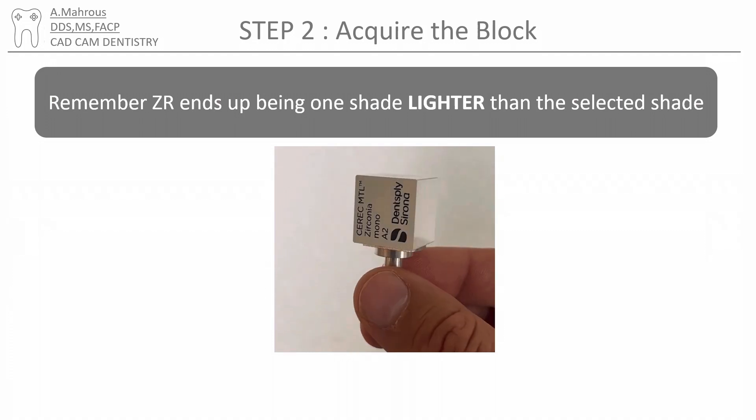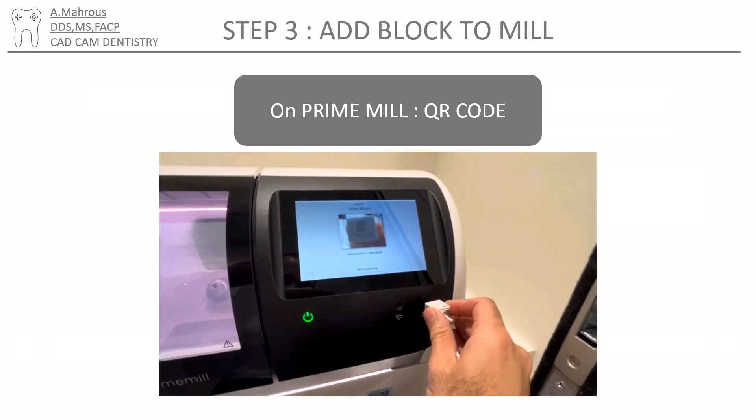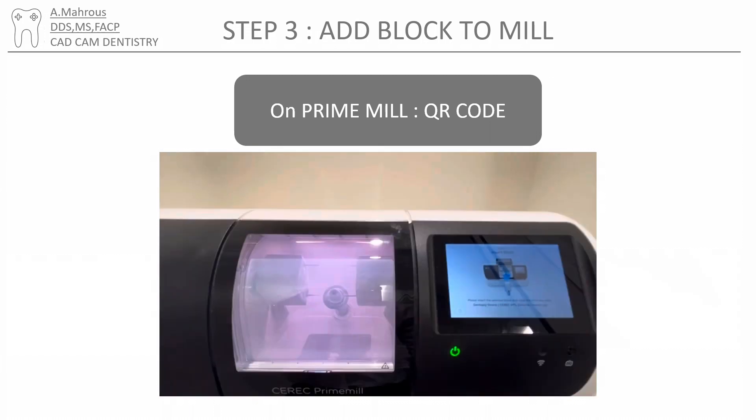The step after that is selecting your block. Remember that most zirconia ends up being one shade lighter than the shade selected. The mill needs to know what type of block you selected. On the Prime mill, that includes scanning a QR code on the top of the block.